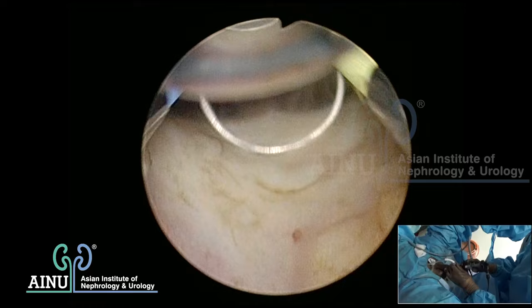I've finished the right side completely. Now looking at toileting of the left side. First thing is hemostasis - the majority of immediate postoperative bleeding problems happen because of vessels left in the roof of the prostatic fossa. Beware and take time to coagulate all vessels in the roof. The roof is clear now.